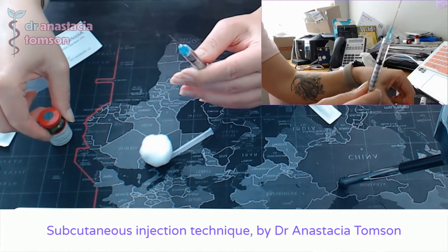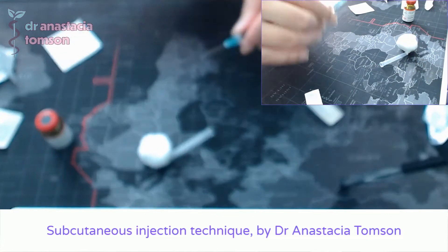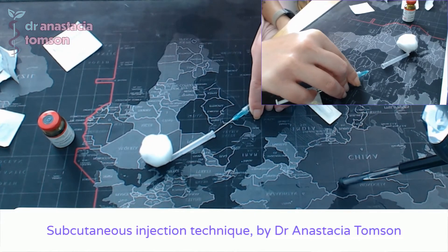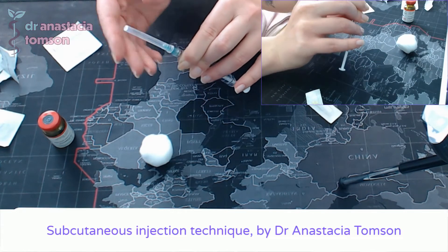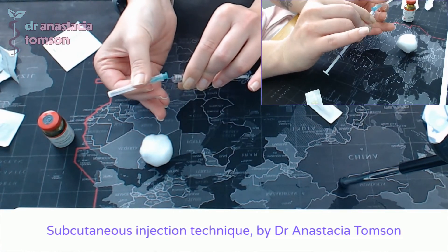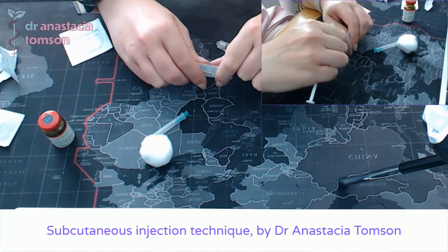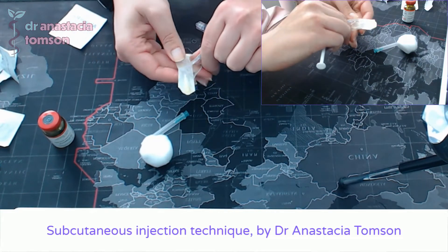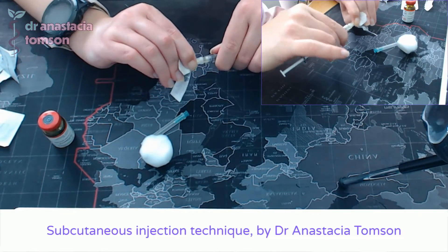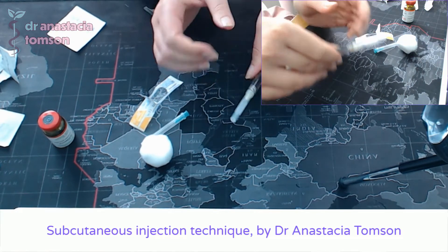With that done, I'll take the needle out of the bottle and recap it with one hand — my other hand is far away so I can't hurt myself — sliding the needle into the cap, tipping it upwards, and clicking it back on. From there, I detach this needle, keep the syringe in my hand, and open the smaller 30 gauge needle the same way: pushing the connector end through the back of the packaging and screwing it on tightly.